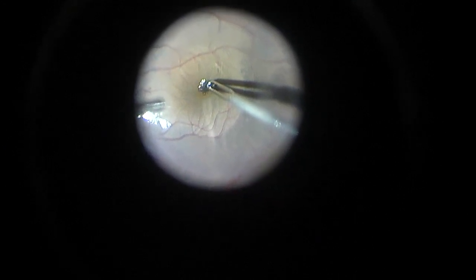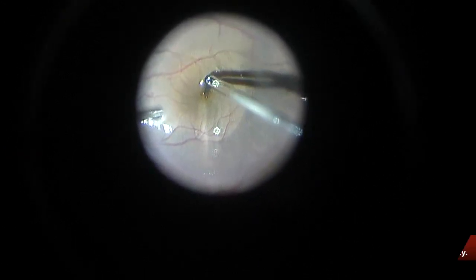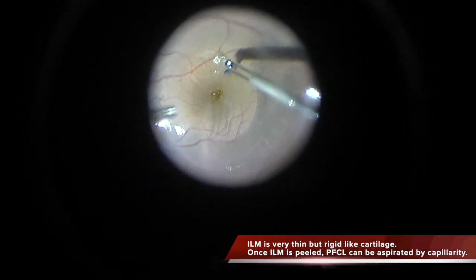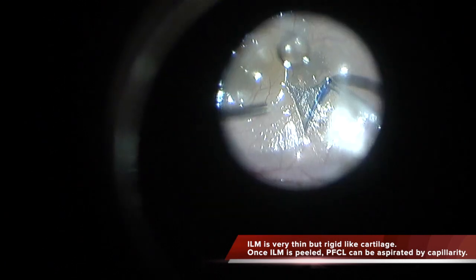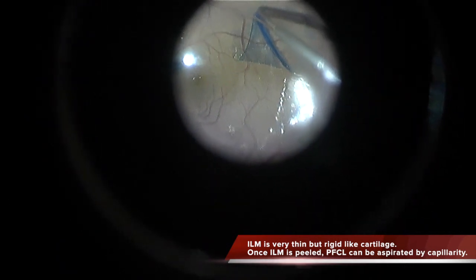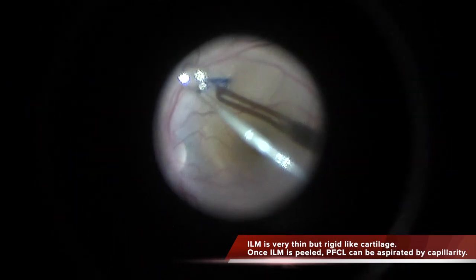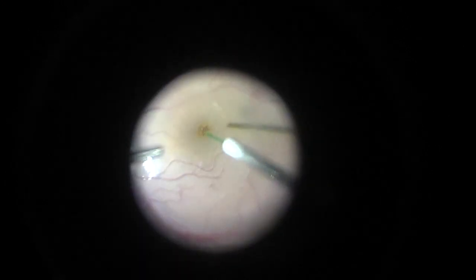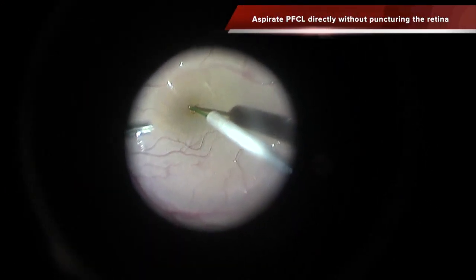Removing the ILM reduces a lot the stiffness of the retina and allows direct aspiration of the subretinal bubbles without puncturing the retina. And that's what we are going to do with a short tip MED1 cannula, which is ideal to aspirate these bubbles.